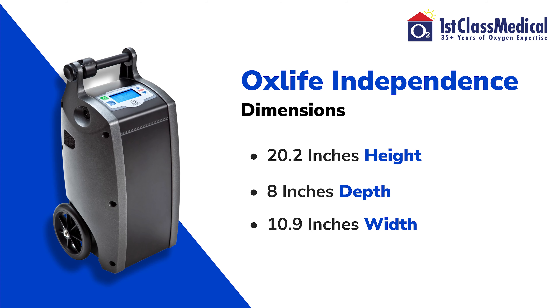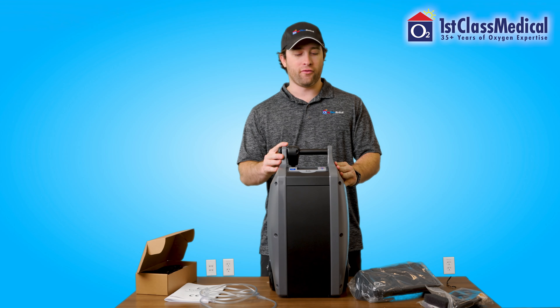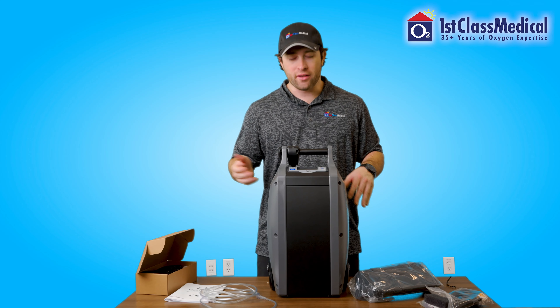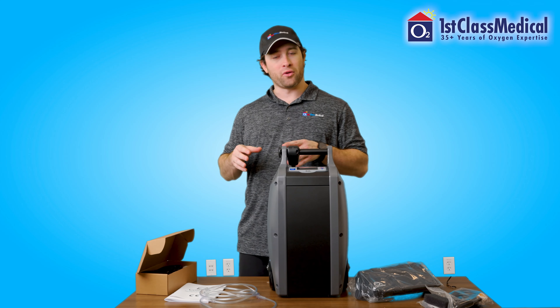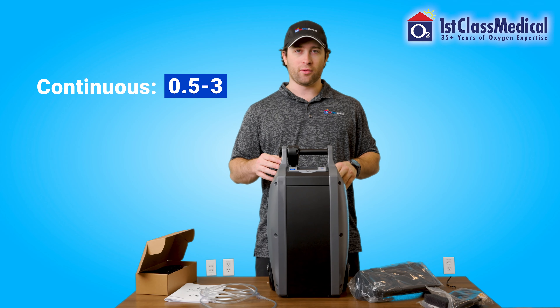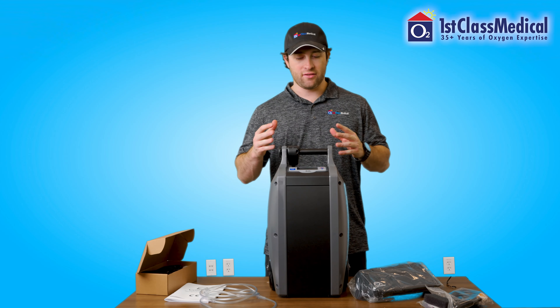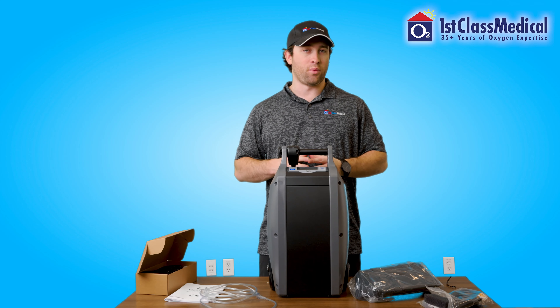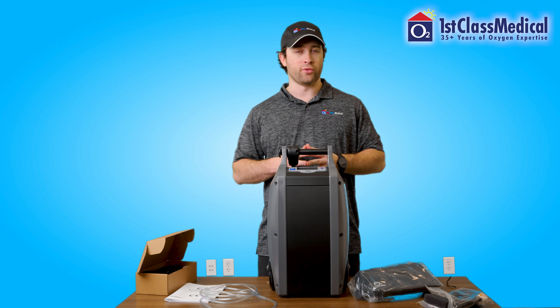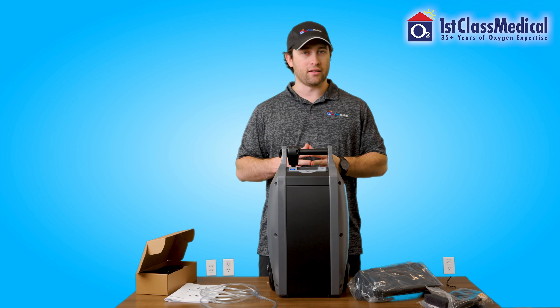The O2 Concepts OxLife Independence dimensions are 20.2 inches in height, 8 inches in depth, and 10.9 inches in width, and it weighs just 19.4 pounds. The reason it's heavier is the compressor needs to be bigger to produce the settings this oxygen concentrator produces — up to three liters per minute on continuous flow and up to a setting of six on pulse flow. Three liters per minute is the highest that portable oxygen concentrators go. But keep in mind, you will have the traveling cart making it easy to carry around like a suitcase.